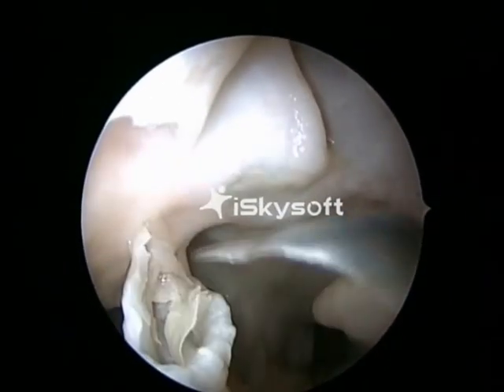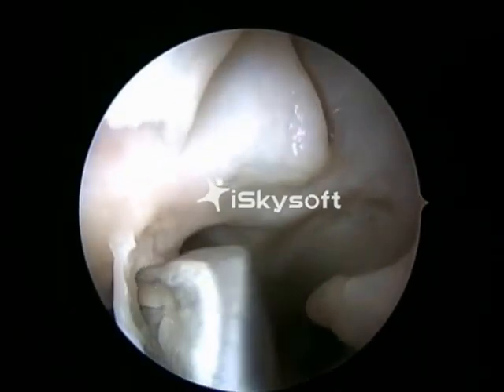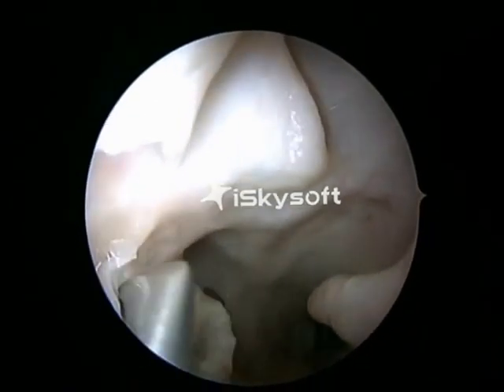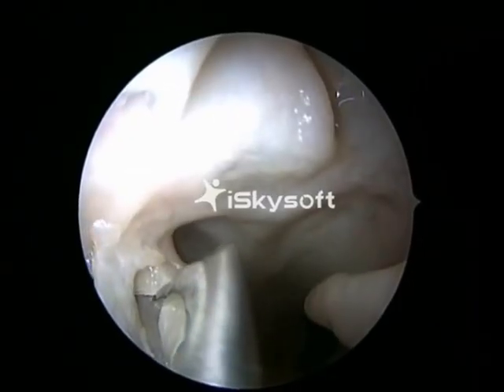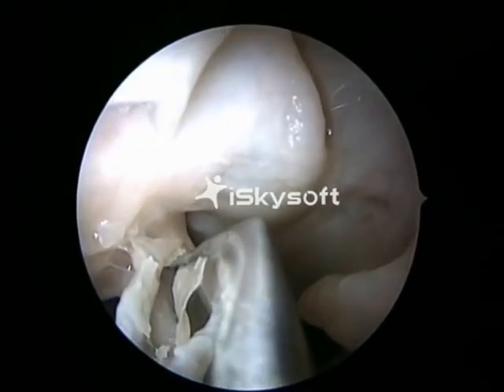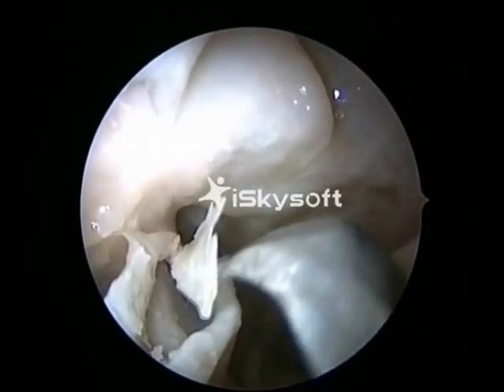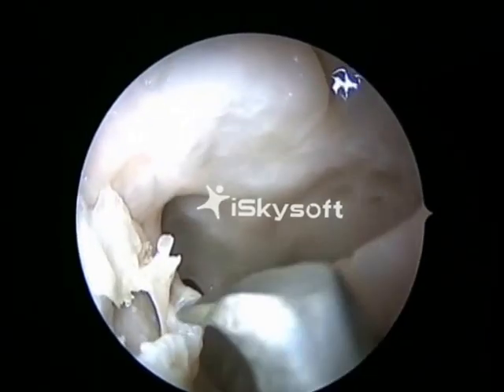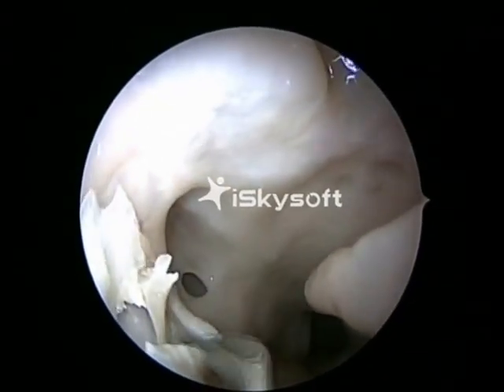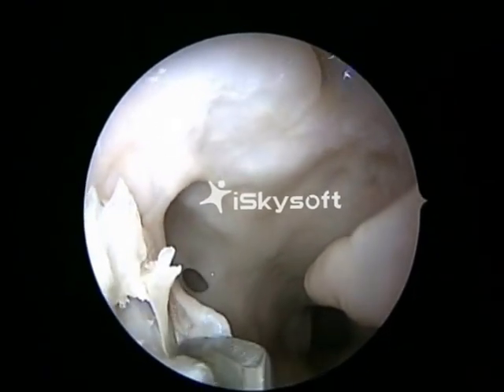We can also see the natural ostium very clearly there. The mucosa on its lateral aspect is being gently teased out and the bone being elevated. This bone can go posteriorly till the palatine bone. We are dissecting that bone of the lower portion of the uncinate process.